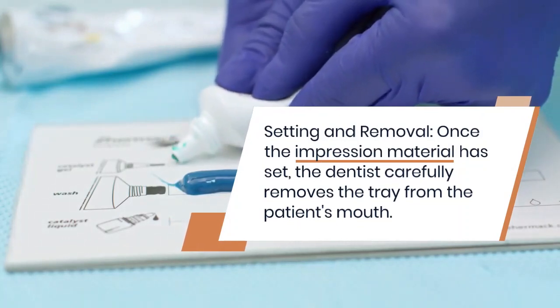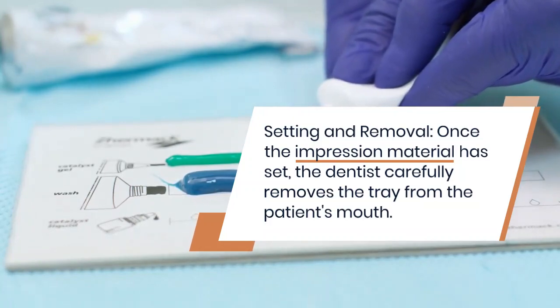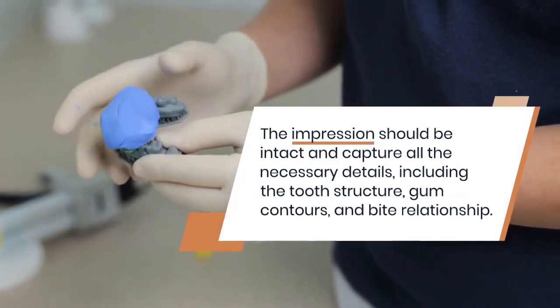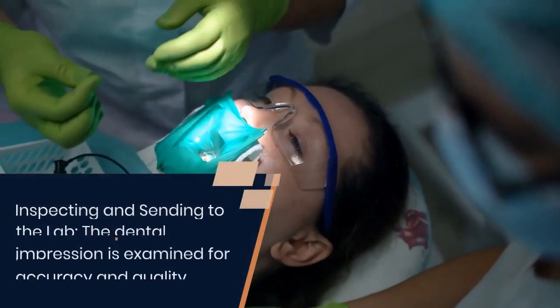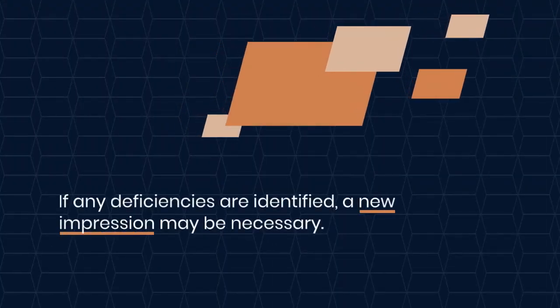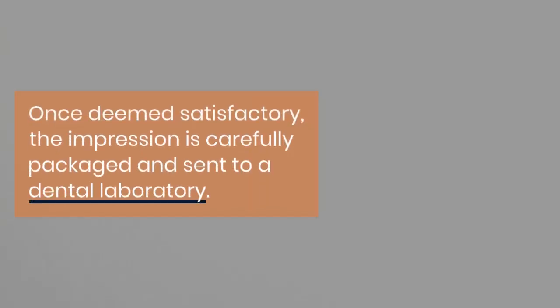Setting and removal. Once the impression material has set, the dentist carefully removes the tray from the patient's mouth. The impression should be intact and capture all the necessary details, including the tooth structure, gum contours, and bite relationship. Inspecting and sending to the lab. The dental impression is examined for accuracy and quality. If any deficiencies are identified, a new impression may be necessary. Once deemed satisfactory, the impression is carefully packaged and sent to a dental laboratory.